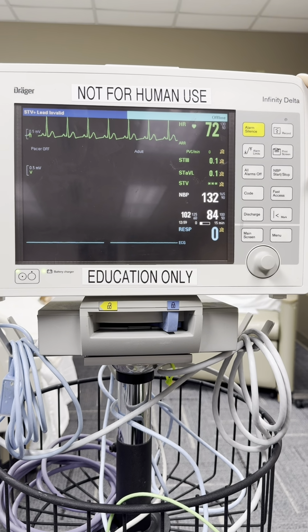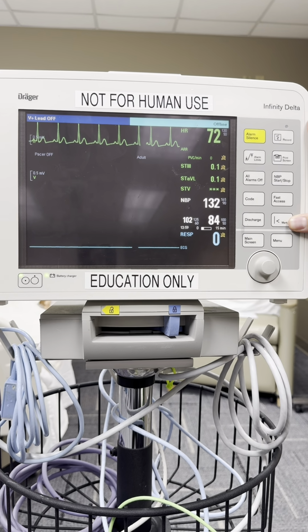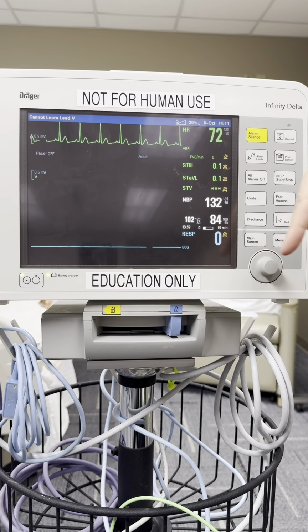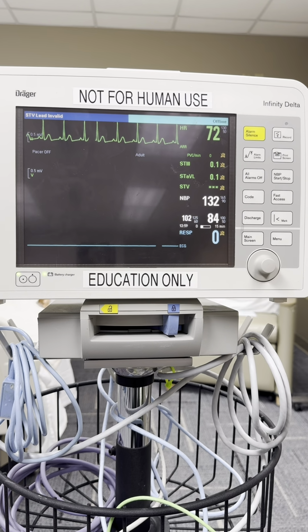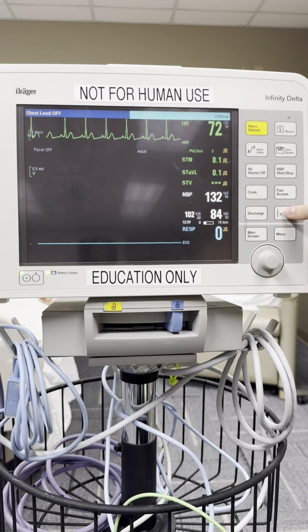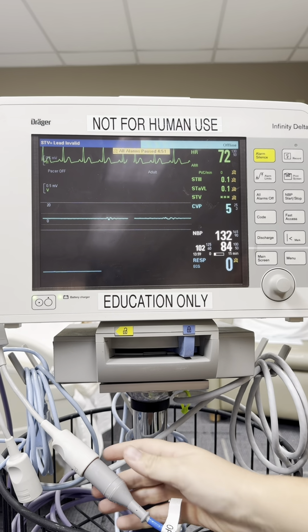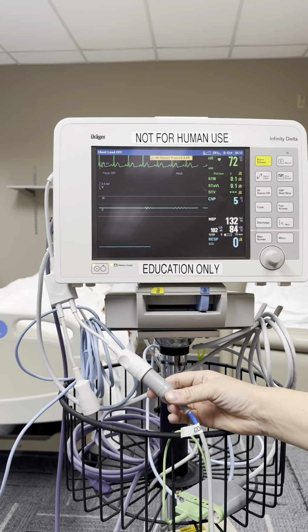Obviously your blood pressure button, and then the mark button can be used if you want to mark a certain time that you've done something. If you're pushing a certain medication or anything significant has happened, you can hit mark, and that will go back in the record.